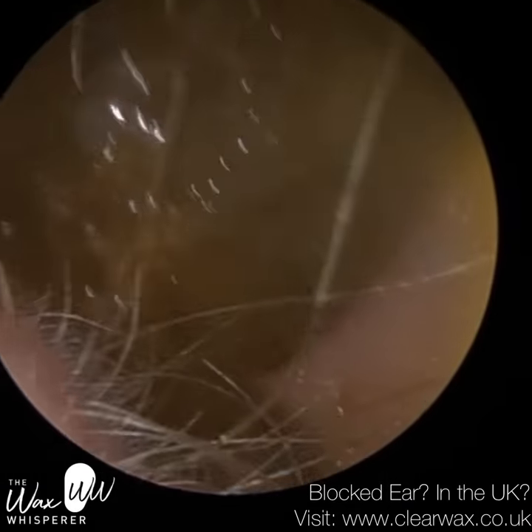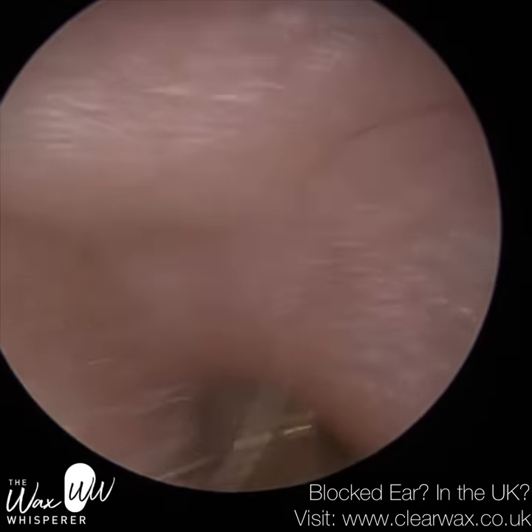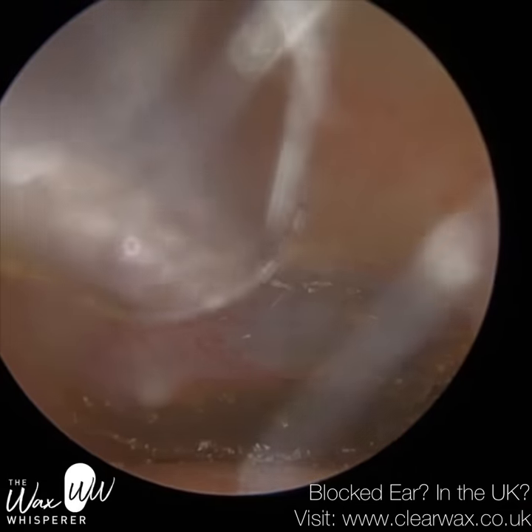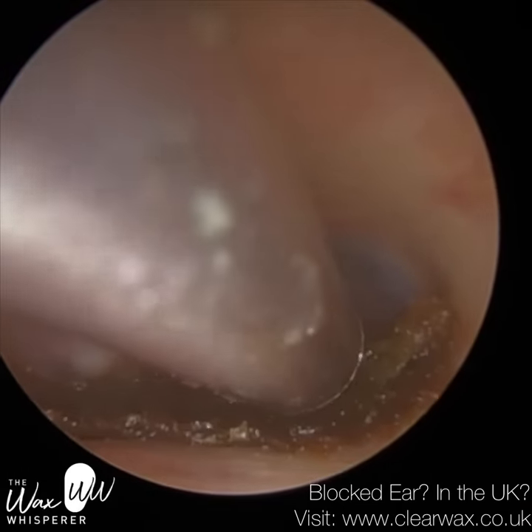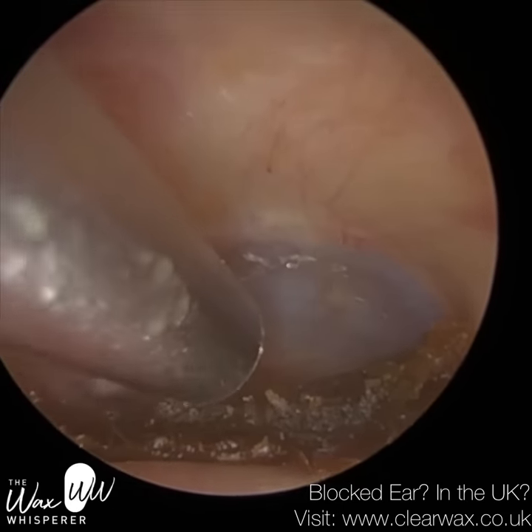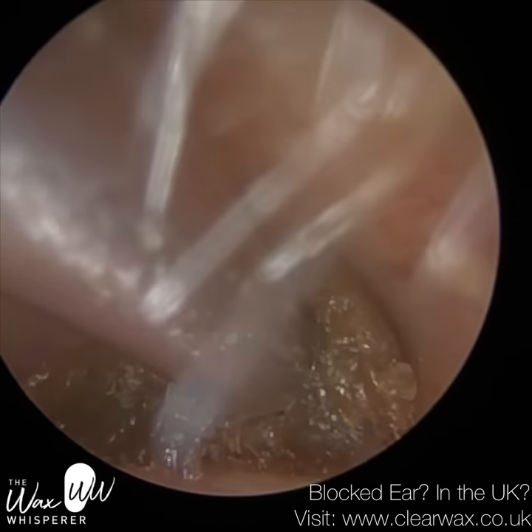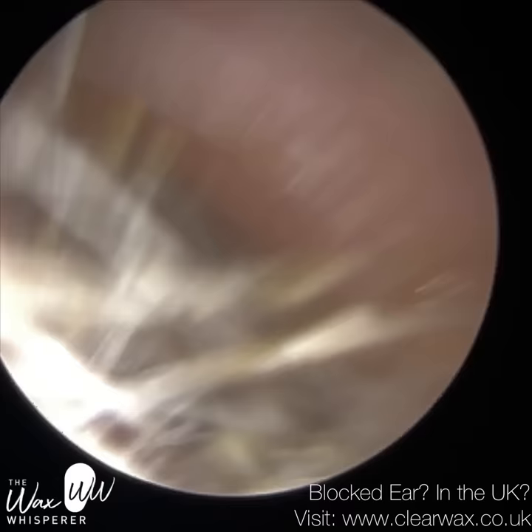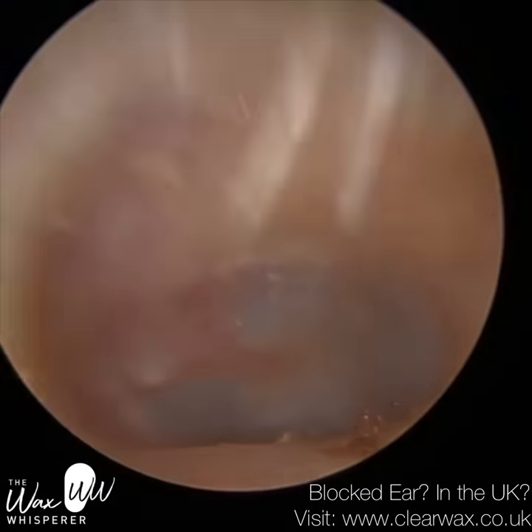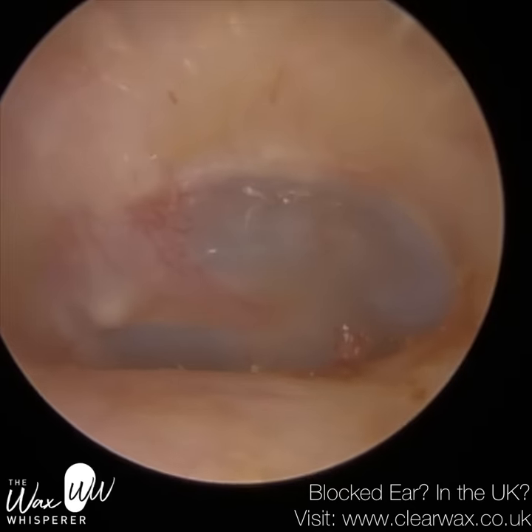It's quite a sizable piece. If you wait till the end of the video, you'll see the still images. You can see probably two-thirds of the eardrum, the posterior two-thirds, but on the anterior canal wall, the front part of the ear, you've got this sticky bit of wax. I'm just using the fine end. I just want to avoid the bony part. You'll see more so in their right ear, but the anterior canal wall is slightly protruded, so it comes more to midline. Probably saw that on screen there. Just a little speck of wax. I'll just vacuum over it.